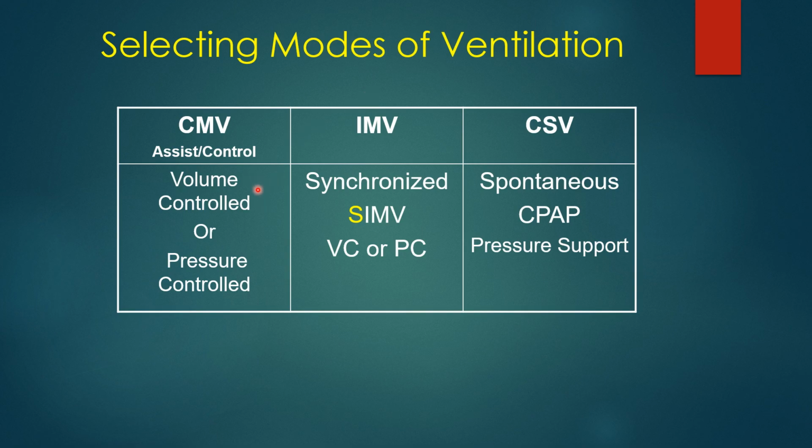Volume control is a knob, a button you select on your ventilator, and it's not a mode. A lot of people call it the volume control mode, but the volume control is the breath type.